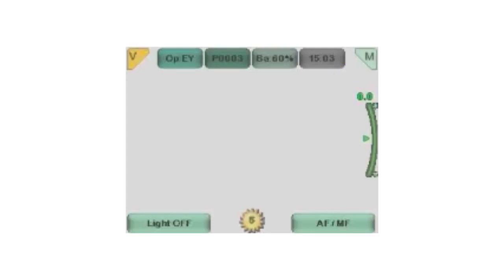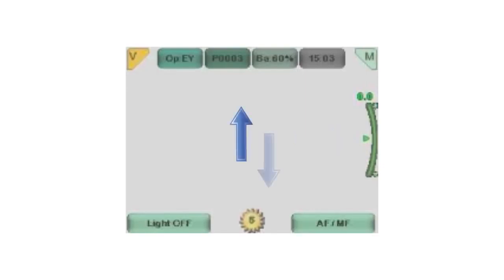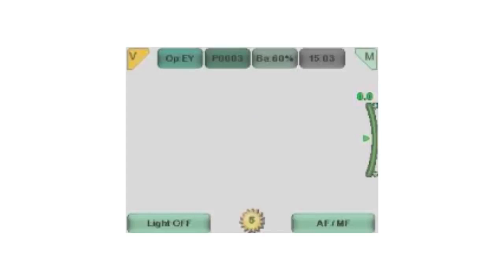When manual focus is selected, you will need to adjust the diopter scale for the refractive error of the patient. By pressing the arrow keys up and down, you can change the focus of the camera. Each click is approximately equivalent to one diopter.